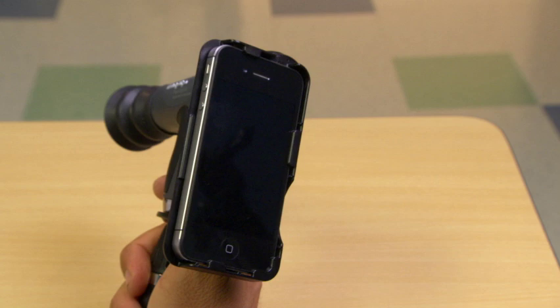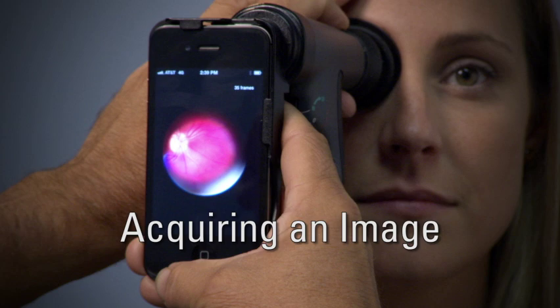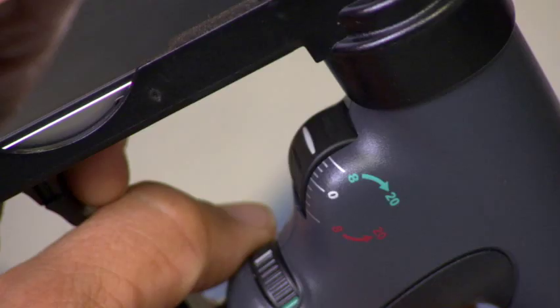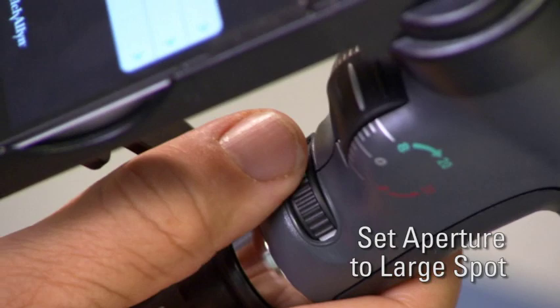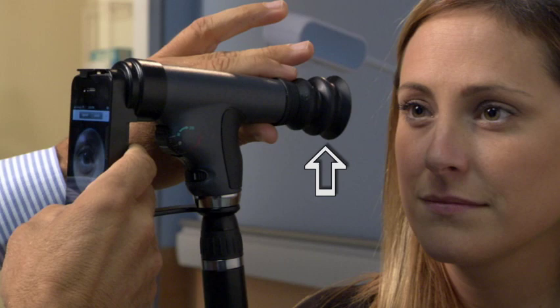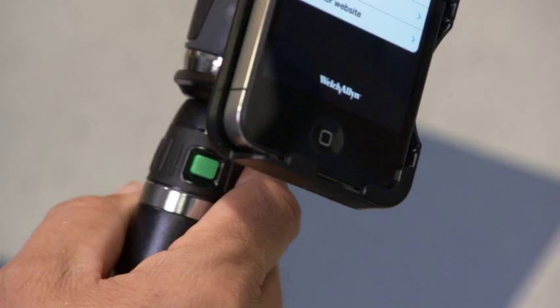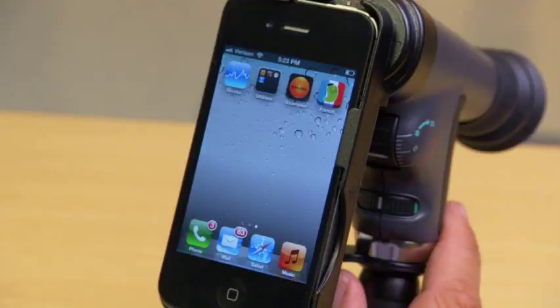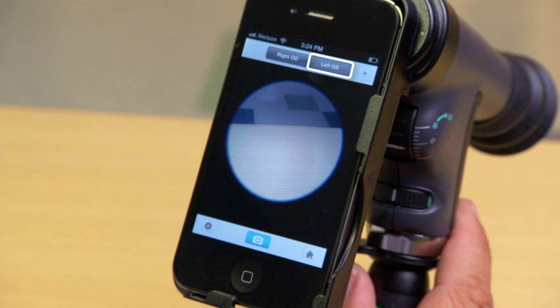The following procedures are intended to guide you as you learn to use the iExaminer. First, attach your iPhone to the Panoptic according to assembly instructions. Set the focus wheel on zero. Set aperture size on the large spot. Ensure the eye cup is secured firmly on the patient's side of the scope. Turn handle power to maximum brightness. Open the iExaminer app and touch Retinal Image. Choose right OD, which is the default selection, or left OS. For this demonstration, we'll start with right OD.